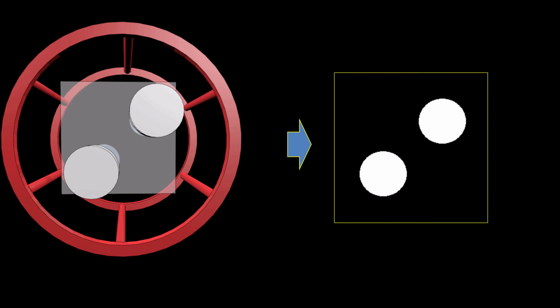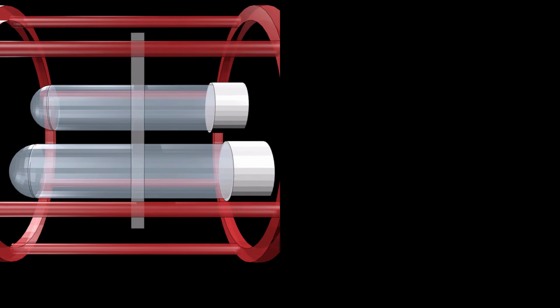And we'll image the water tubes with axial slices today. That means our excitation slice will be perpendicular to the z-axis like this. I'm choosing this phantom because it's a simple geometry but with some defined structures, so we'll know exactly what to expect once our MRI is reconstructed. Okay, so let's zoom in on the spins in our phantoms and see what's going on.